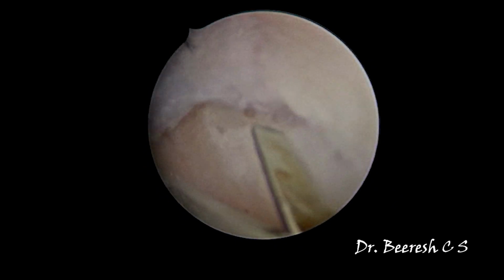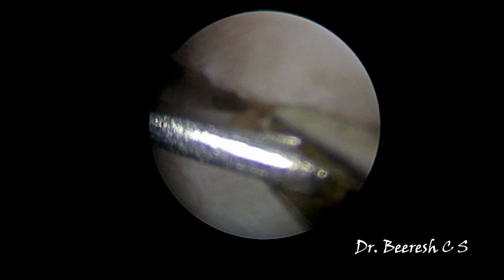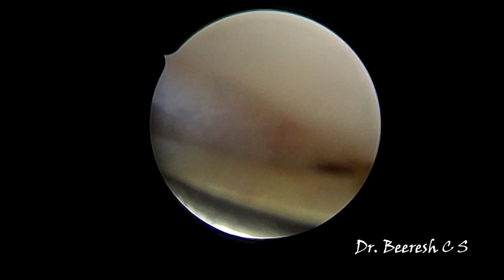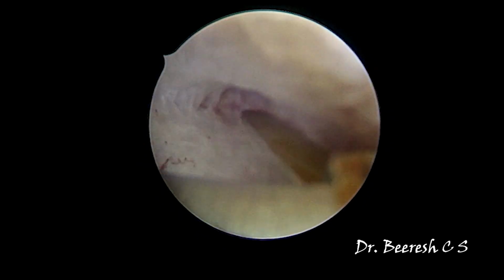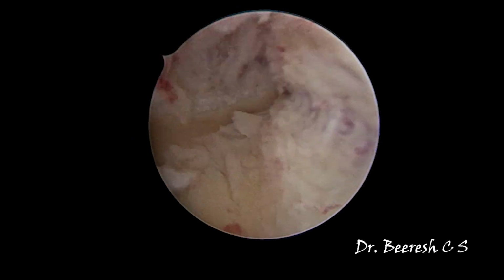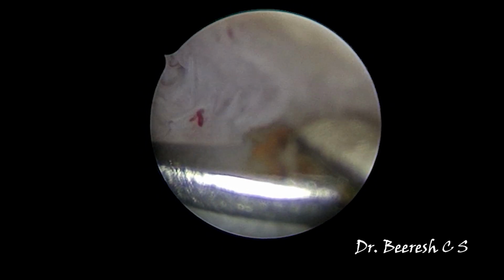Now I move on to the right side. Same thing: I keep the entire hysteroscopic operative sheath as one complex, trying to move the entire system of the operative sheath rather than just moving the scissors.